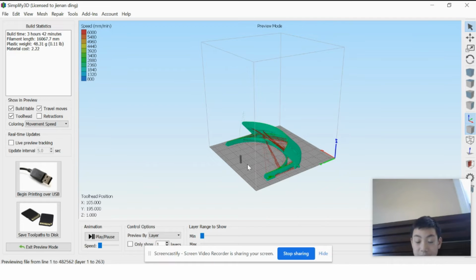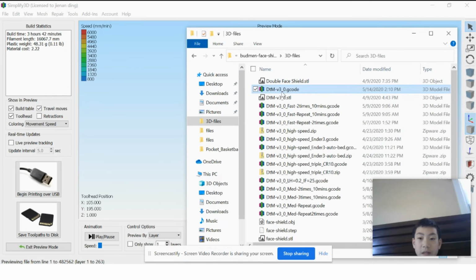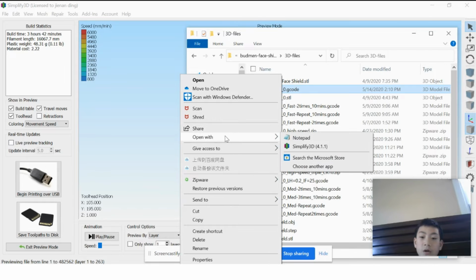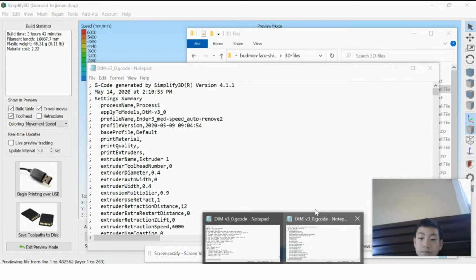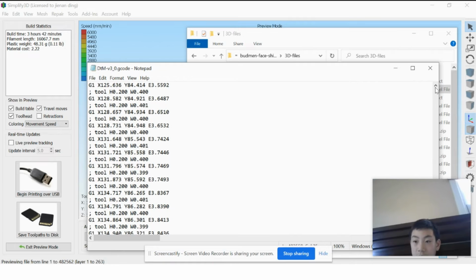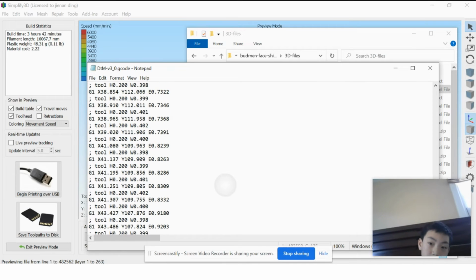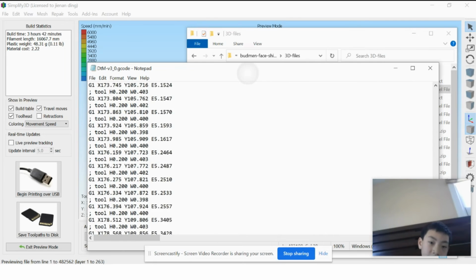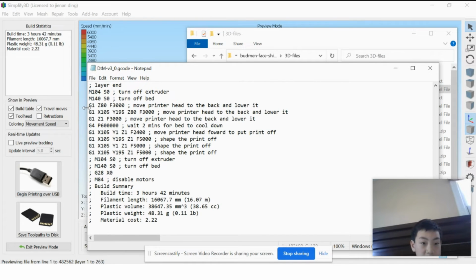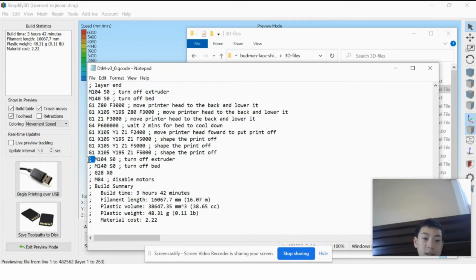Alright, next, we will want to save it, which I already have done. So I'm just going to go to it, and press open with Notepad. In Notepad, you will see all the printing and everything, but I don't want to see this. I want to see the ending. This is the part we wrote to make the print go off. And these old things, we don't need them anymore because we already turned off the extruder. So we just make them comments by putting a semicolon in front.